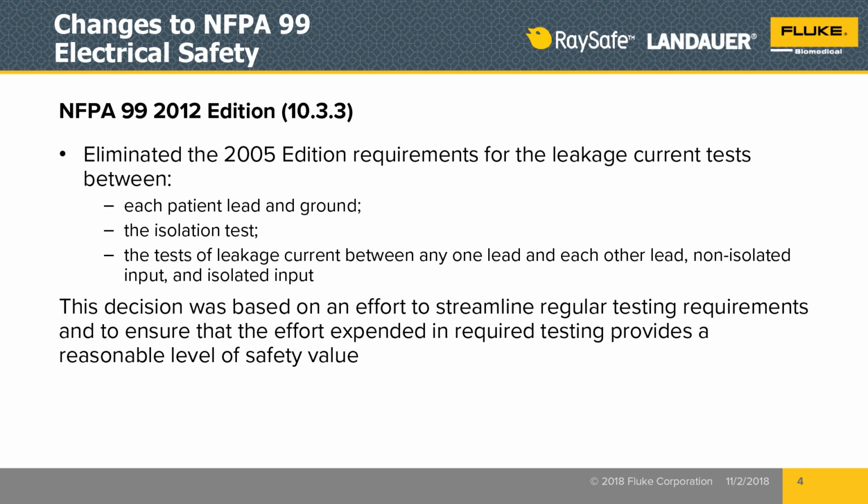The isolation test itself was completely removed, as well as testing leakage current between one lead and every other lead for non-isolated and isolated inputs. And the decisions were made by the standards body for a number of reasons: to streamline the testing, to ensure that there's still a reasonable level of safety, but to improve things as times are changing and medical equipment is getting better and failing in different and maybe less frequent ways. So it's the standards trying to catch up to what the realities are today for testing.